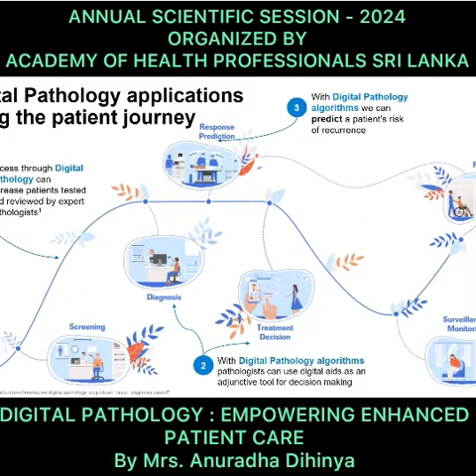When you access those digital cases, the digital pathology algorithms help the pathologist give the correct diagnosis, and they help in decision making also.